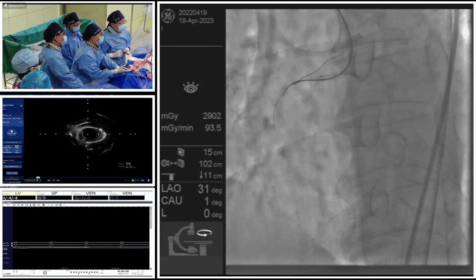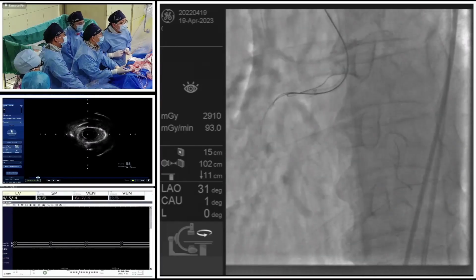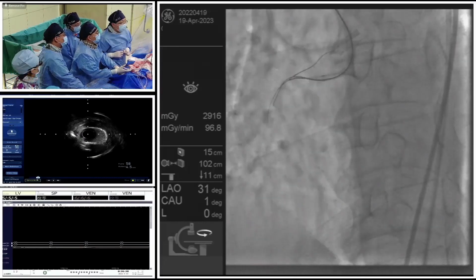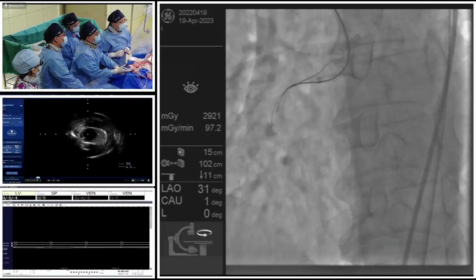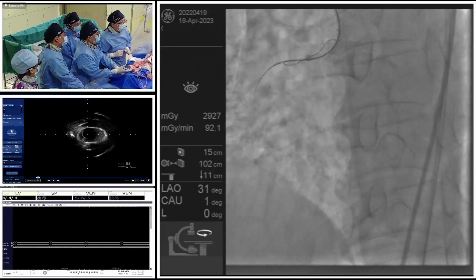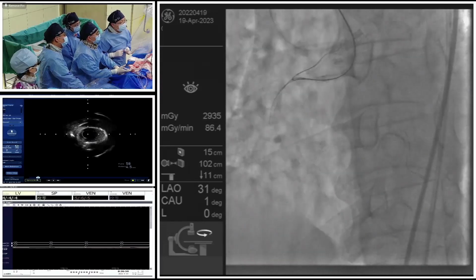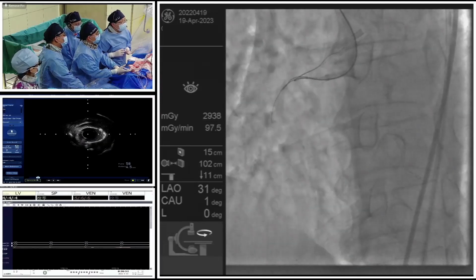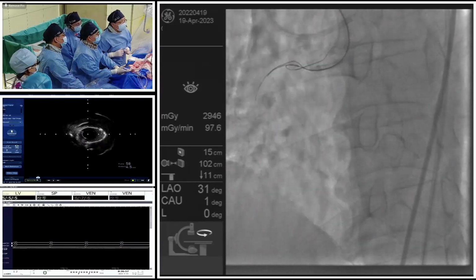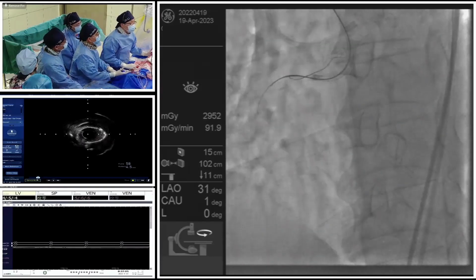And also, as Dr. Lee mentioned, control of the antegrade hematoma is quite important. In a lot of CTO cases, even after the wire manages to re-enter the true lumen, we can see a very long, huge hematoma, which can cause the stenting strategy to fail. So the control of hematoma is quite important in the antegrade approach, and we are using contralateral collateral flow to confirm the wire position.